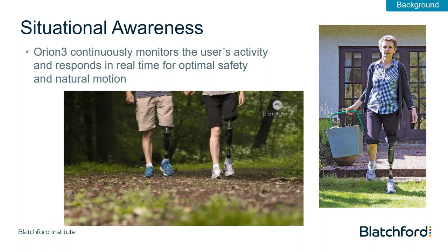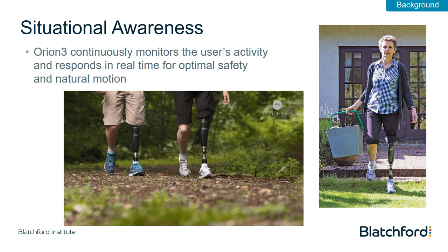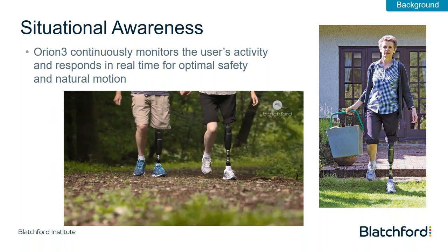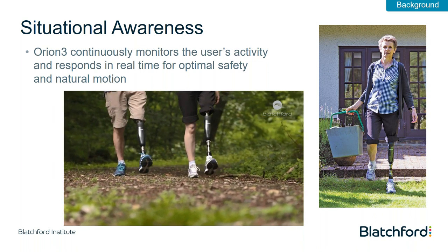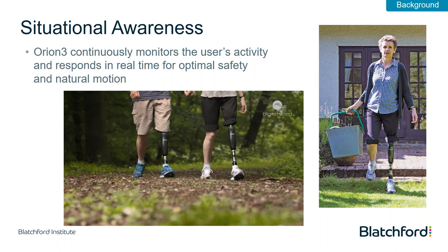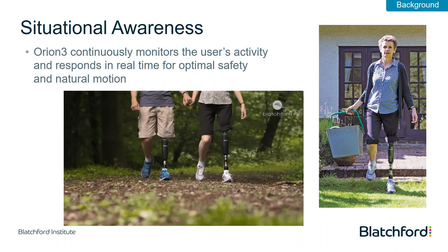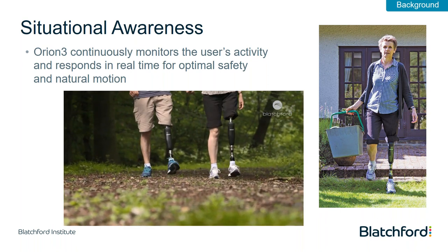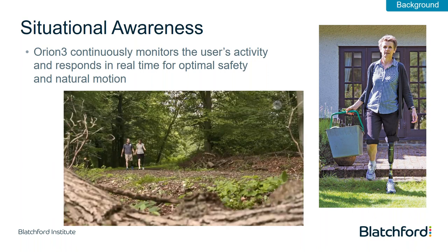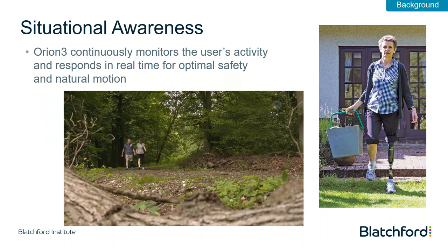This is best described by a doctor who I know, who states that if a microprocessor knee is working well, the patient shouldn't realize that it's doing things and changing. It should just happen. Now, as mentioned already, I am still a practicing clinician. Today, I attended a patient here in London, in Crystal Palace. Crystal Palace is the highest point in London, and at the top of the hill we have the artificial limb centre. So no matter how a patient comes to us, they have to walk up or down a steep hill to get to our front door, and the leg should be able to adapt to this to keep them aware.